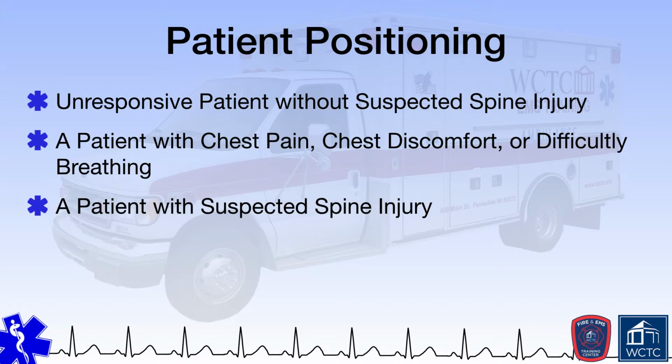If your patient has a suspected spine injury, ensure the patient is immobilized per your agency's protocols. In the past, this used to mean full immobilization on a longboard with a C-collar and cervical immobilization devices. Now, with selective spinal immobilization protocols becoming more popular, this may mean using a vacuum mattress, the cot itself, patient self-splinting, a C-collar, or other means to ensure the patient's spine is properly immobilized without generating additional problems or discomfort.